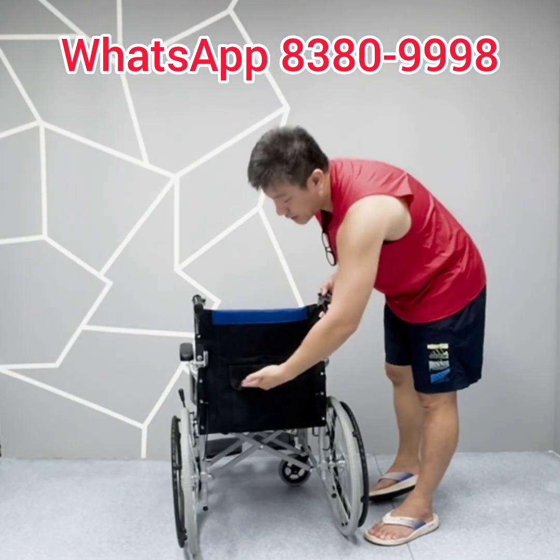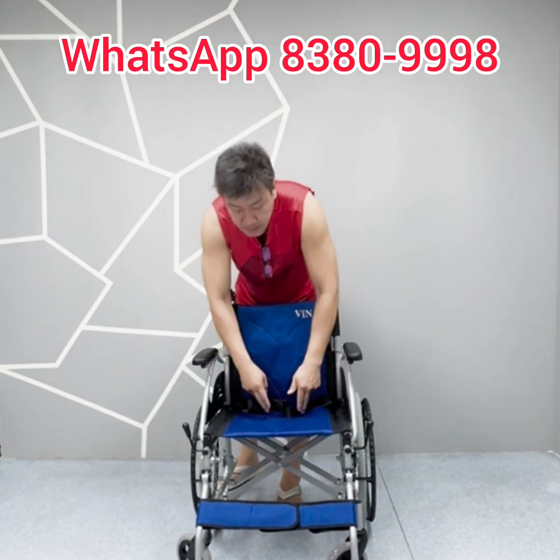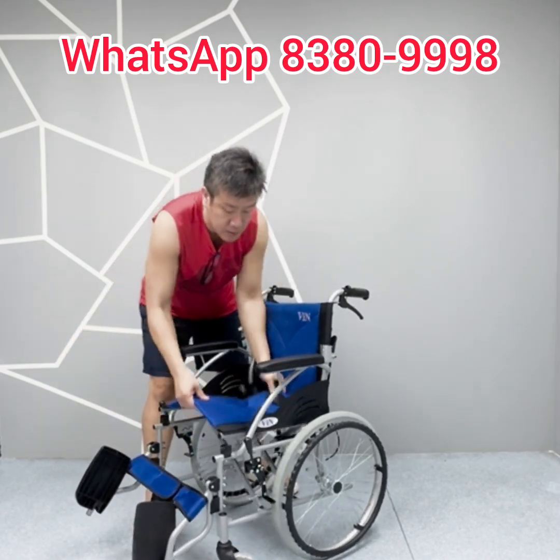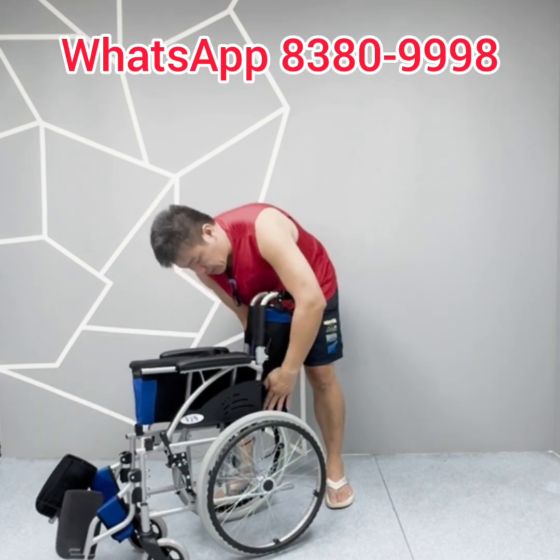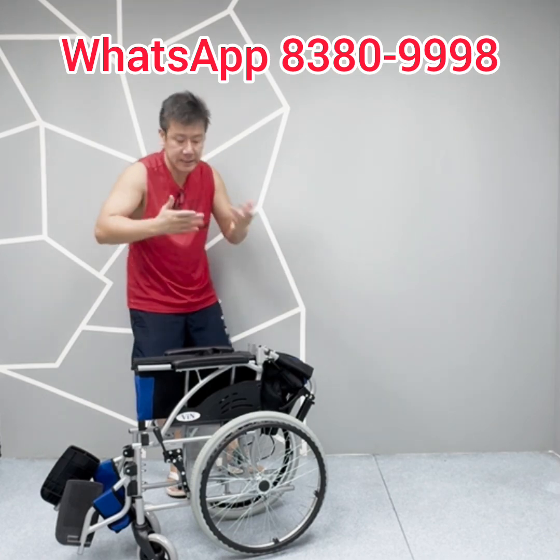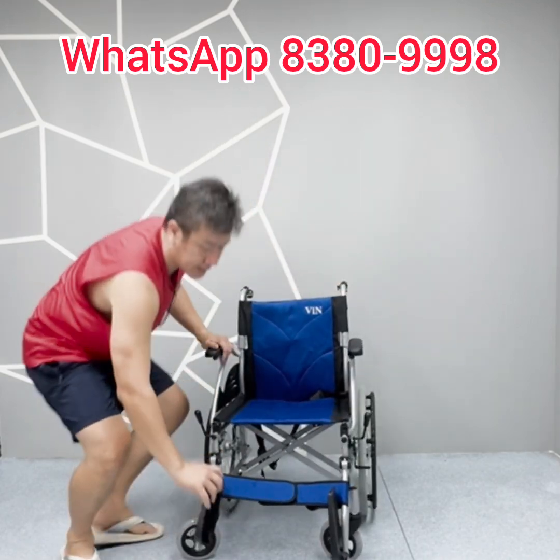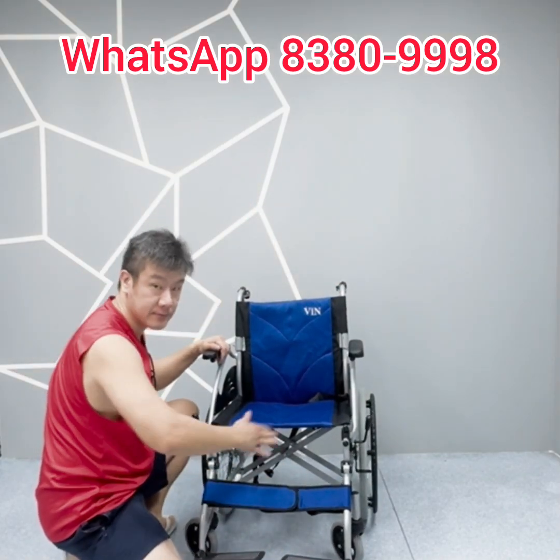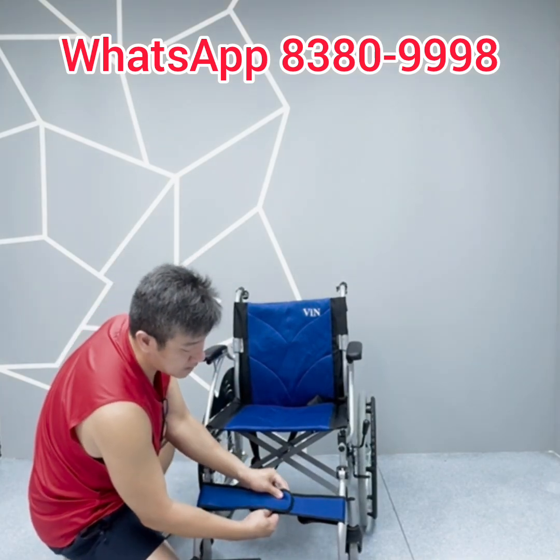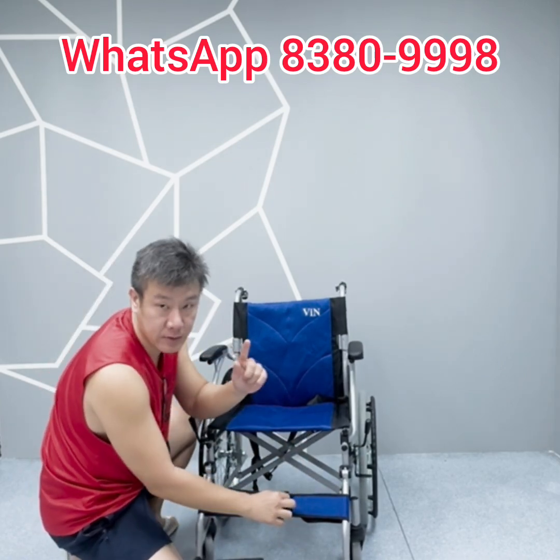This wheelchair also comes with a rear pocket. The seat cushion features a leaf-and-seed design — the leaf-cut pattern allows the cushion to fold very neatly when closing the wheelchair, following the contour of the leaf design so it stays compact. The footrest includes a leg strap to prevent legs from flipping backwards, and it can be easily removed if required. The Velcro is super tough — not the weak kind that easily comes off — but can still be easily removed at the same time.